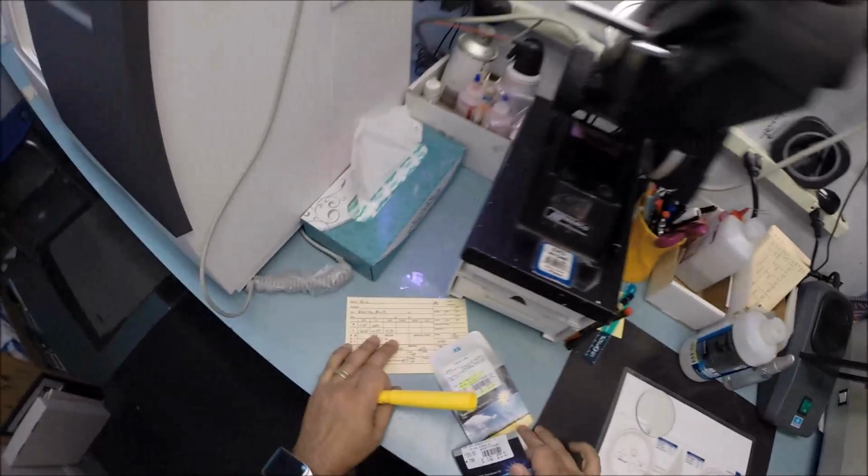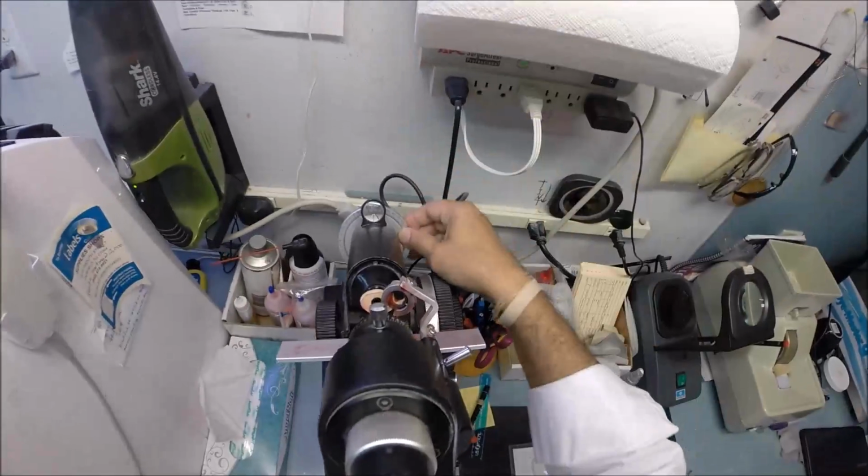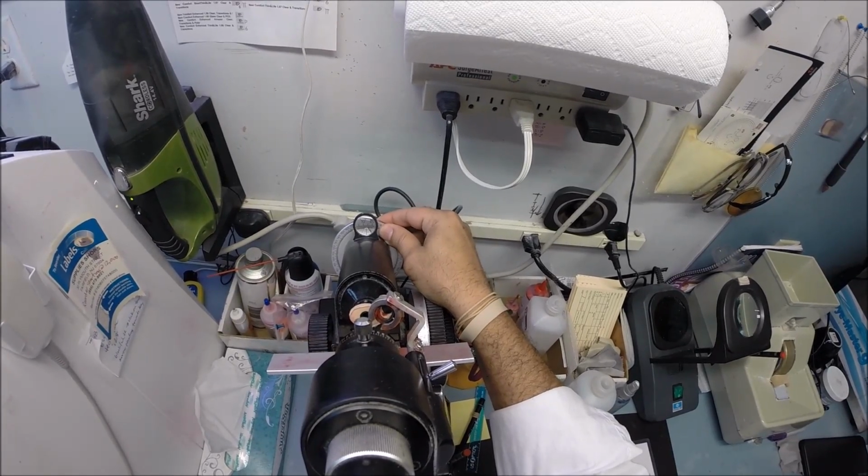Let's do the same thing now for the left. -2.75 at 13. Where's my camera? Am I getting this? Let's turn it to 13.